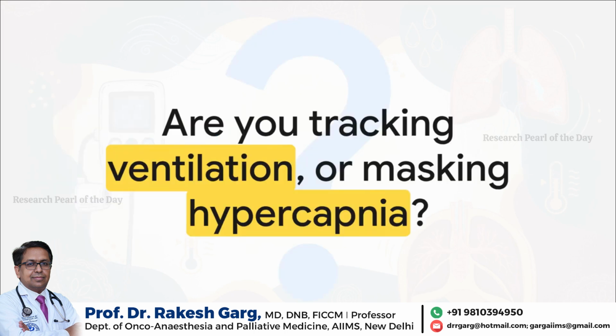So I'm going to leave you with this provocative thought to really challenge your day-to-day clinical practice. If a normal SpO2 during high-flow nasal oxygen feels safe to you, are you truly monitoring your patient's ventilation, or are you just masking the rising threat of hypercapnia? Remember, always treat the whole patient and their complete respiratory picture, not just the glowing number on your screen.